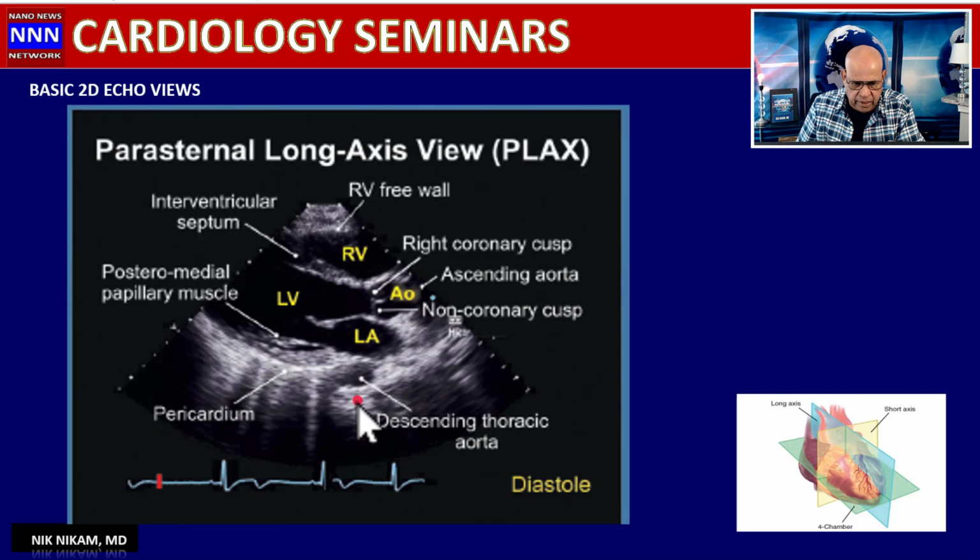And anything that accumulates behind the aorta is pleural effusion, and we see a coronary sinus here. Also, anything that is in line with the coronary sinus and inside the pericardium is the pericardial fluid. So these are some of the basic structures. Of course, we look for calcification of the valves, valve malfunction, and mitral valve prolapse can be detected here.